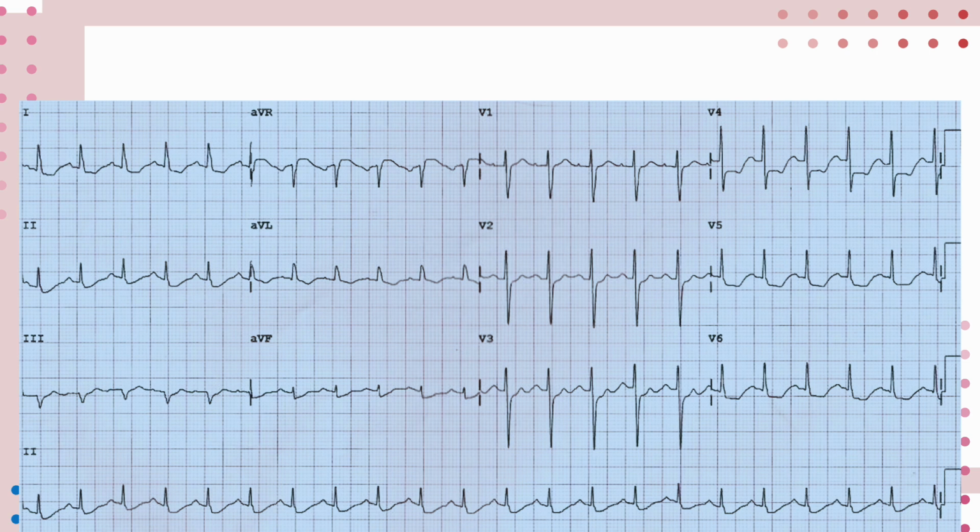So what is the context? Let's assume that, for instance, I see an ECG and the ECG is just chaotic waves looking very abnormal. And I say, oh, where is this patient? Let's say the heart rate is about 300 and I'm just seeing chaotic waves. And they show me the patient, and the patient is just right across the emergency department, smoking, laughing, happy. I know that ECG is most likely wrong.